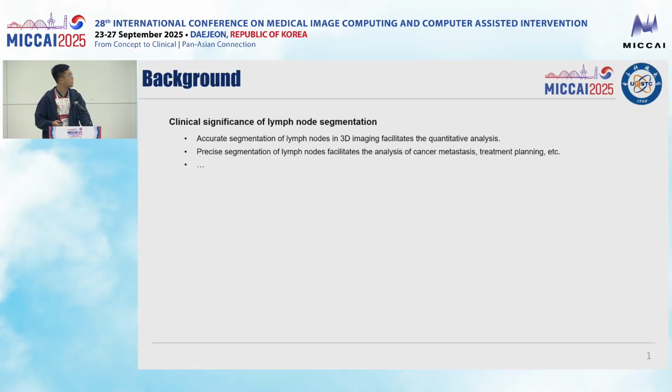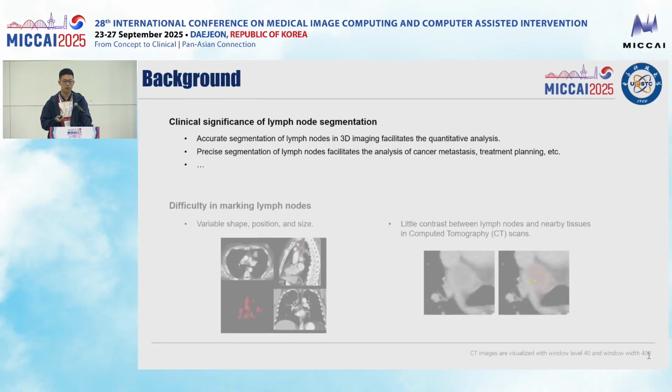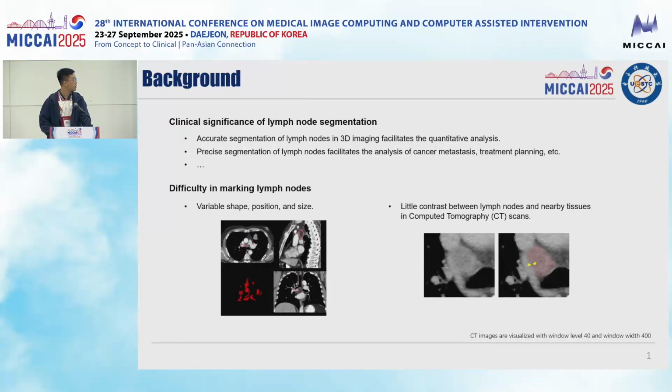So first, for clinical significance, the accurate segmentation of lymph nodes can facilitate quantitative analysis. For example, you can calculate the short diameter in a 3D perspective and not a 2D view. The second is that precise segmentation can also facilitate the assessment of cancer metastasis and treatment planning.